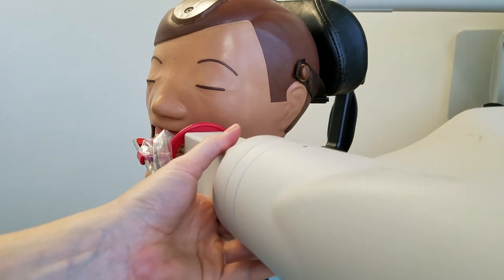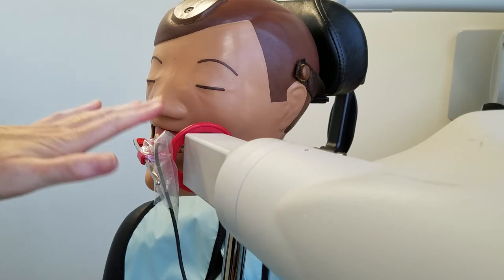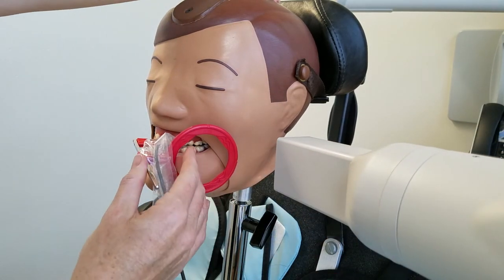Once we set everything up — we have our contact open and our right angles — we take the film and see what we got. Did we get a lot more of the canine than we thought and not see the distal of the second premolar? That might tell us we probably need to take two more images. Or did the film end up showing the canine, the premolars, and even a little bit of the mesial of the first molar? Then we can say maybe we only need one more film. We just have to play it by ear with the verticals because it's a little bit different.